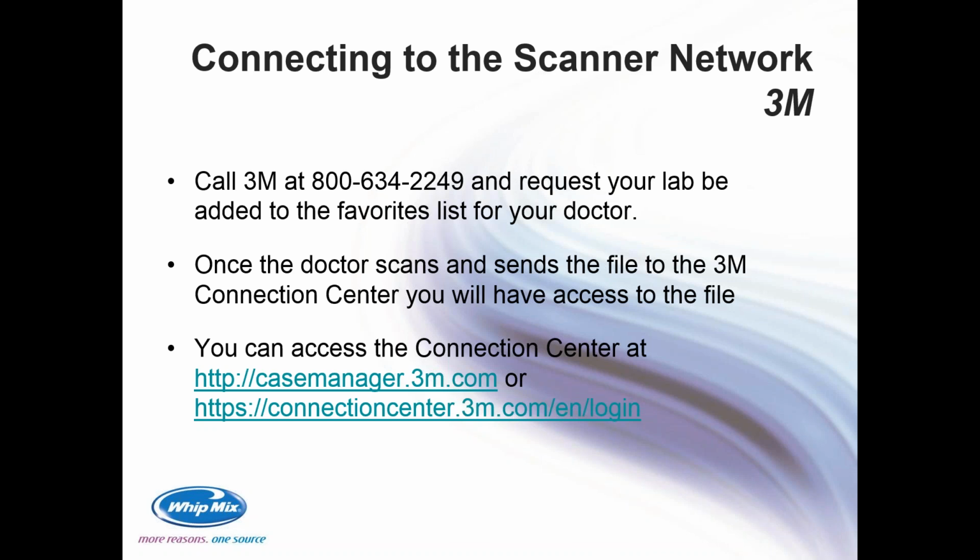the standard lab package. So that's different than just getting a model printed. With the 3M, you have to go into the Connection Center to download the STL, and you do have to have a subscription to the standard lab package just to be able to go in and pull down the STL file.